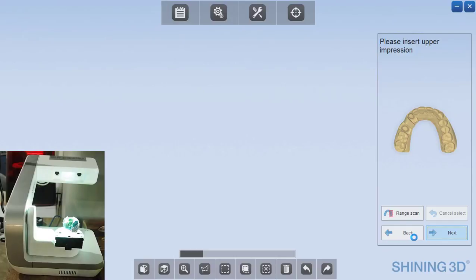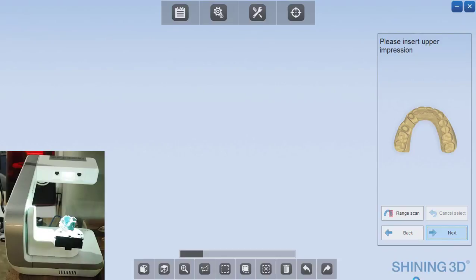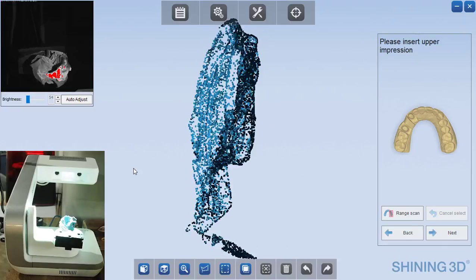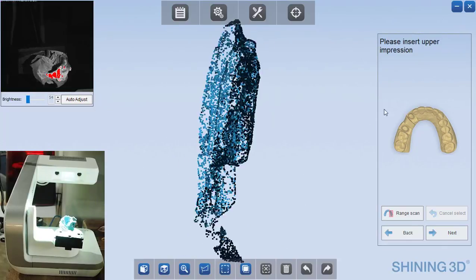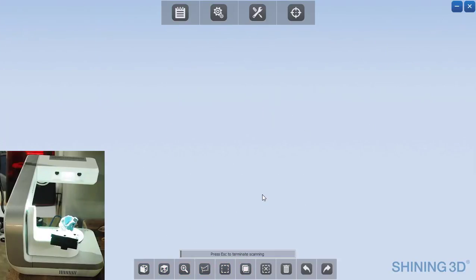So I'll click next and now we just need to flip the impression. So it's just very simple, flip it over. Right now the software is generating the 3D rendering of that and now we're ready to do the opposing side. Next.